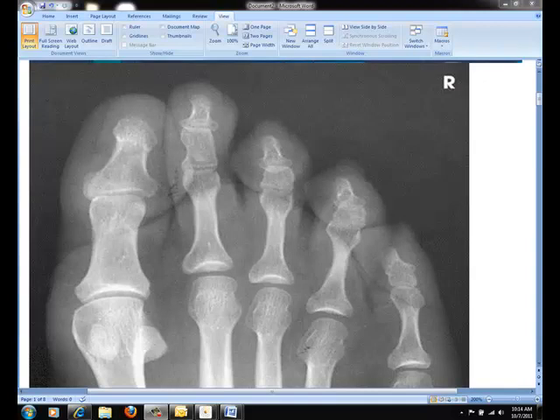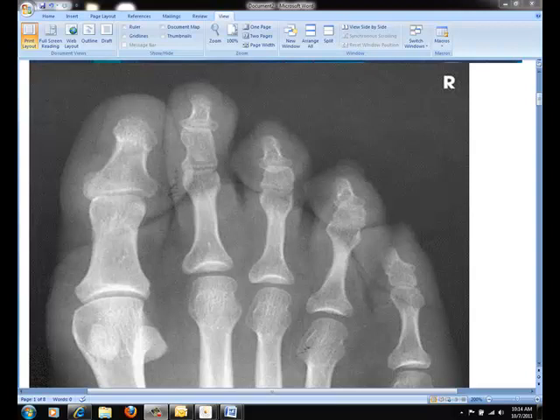The following image is an image where the joint spaces are not of concern. The image shows 14 phalanges of the toes, the distal portions of the metatarsals, while demonstrating evidence of proper collimation and no rotation of the phalanges.